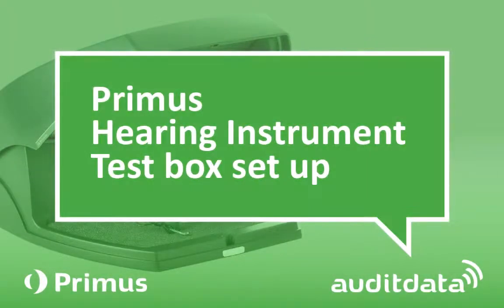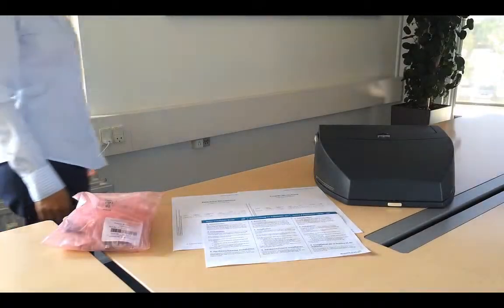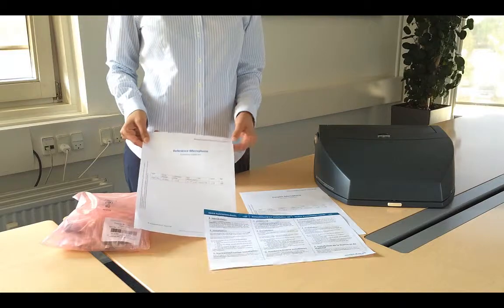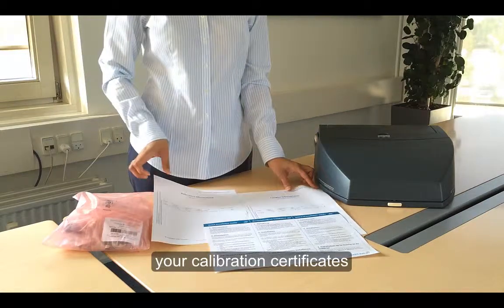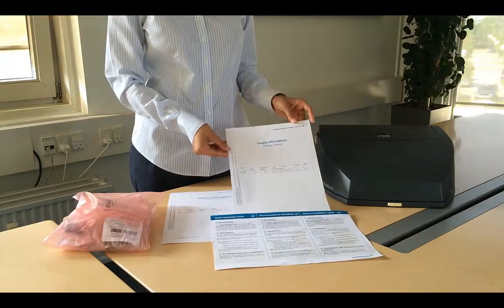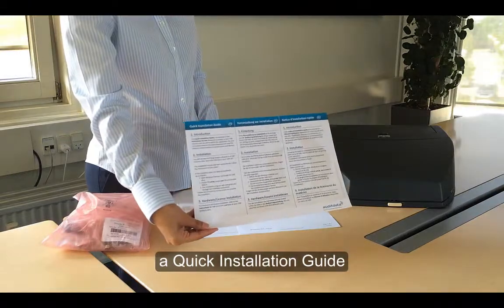This video will show you how to set up your Primus hearing instrument test box. In your delivery you will find the coupler microphone and the reference microphone calibration sheet. You will also find the quick installation sheet.